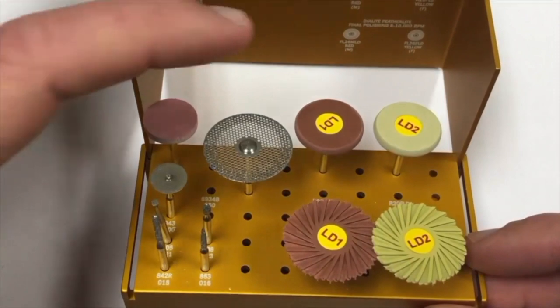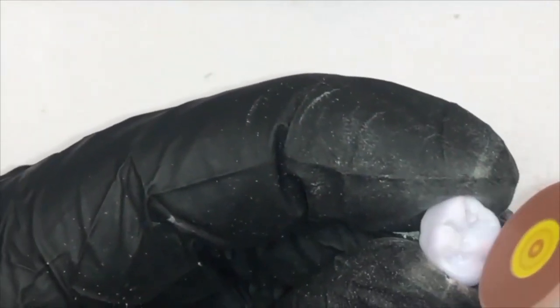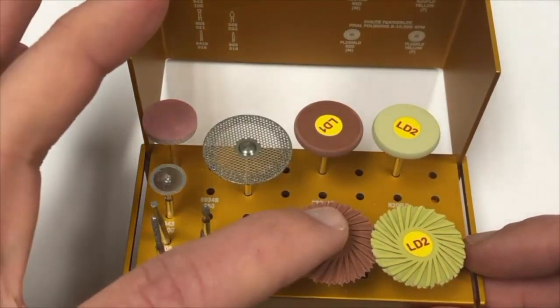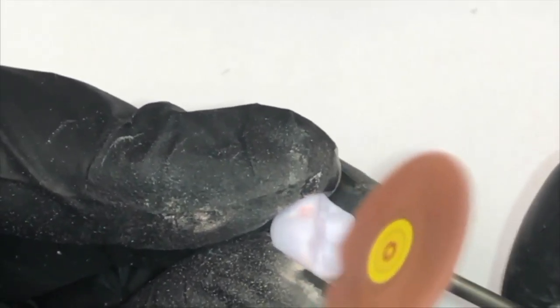To begin polishing a posterior ceramic restoration, the first step is the LD1 medium Dialite Wheel, which will remove the major burr marks from both the milling and contouring of the crown. It is best used on the axial surfaces, contact points, and high spots on the occlusal surface at 8,000 to 10,000 RPMs. After finishing with the LD1 Dialite Wheel, the next step is the LD1 medium Dialite Featherlight Polisher, which will better adapt and polish the deeper areas, grooves, and anatomy of the occlusal surface.